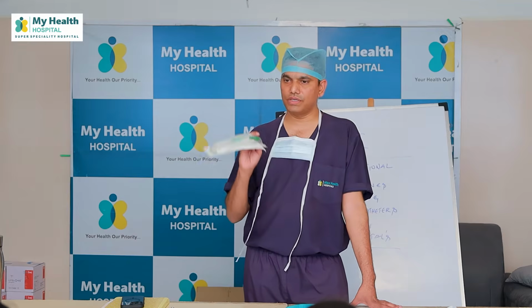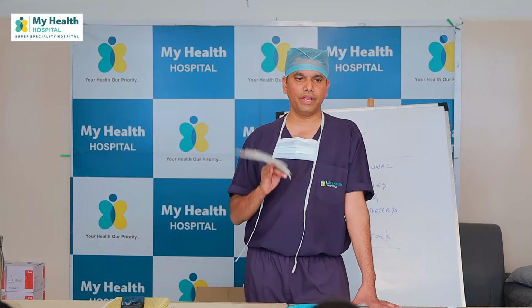In elective scenarios, for feeding. In other patients where we need to do it, like in stomach decompression, when the patient is posted for procedures, upper abdominal surgery, we will place a Ryle's tube. What is the ideal number of the Ryle's tube for feeding?